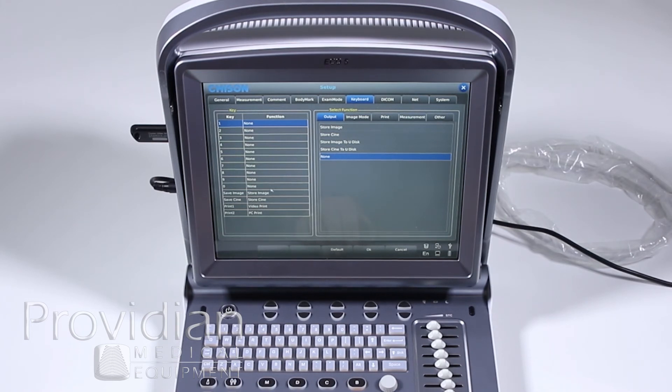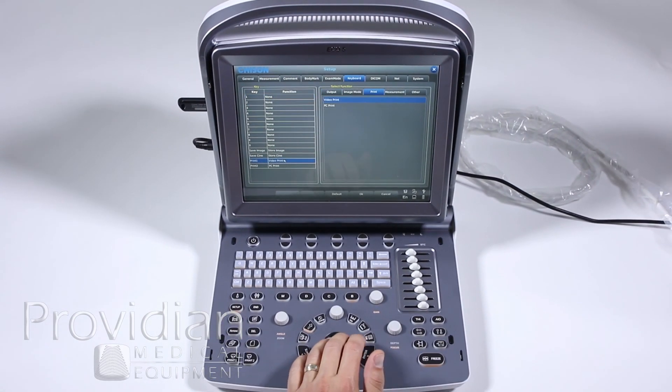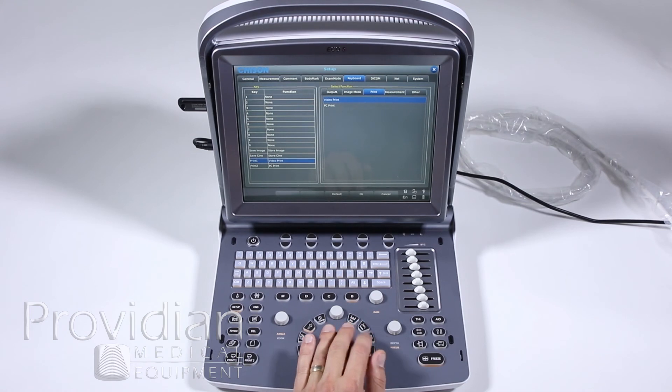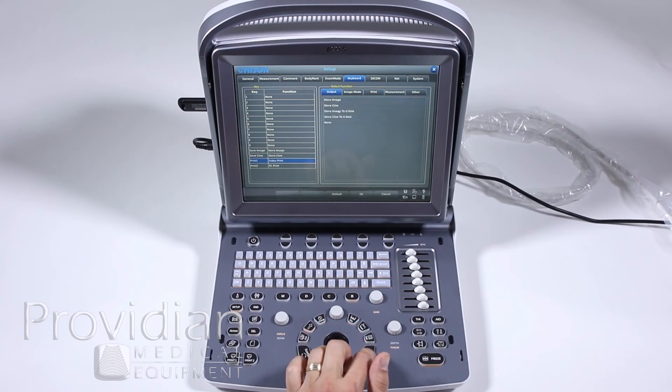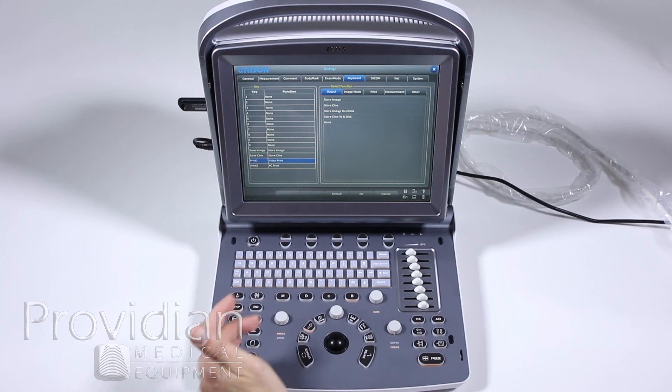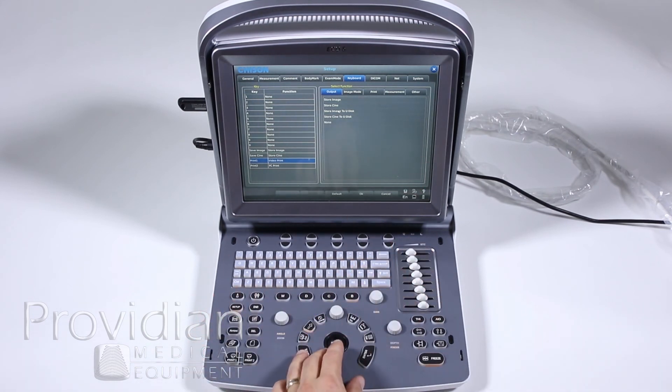What would be more helpful actually is if you don't have a printer attached, it would be better to assign print one or print two. If you want to go straight to a USB, you can say store image to U disk. So if you've got the USB, you can hit print one, it'll jump it right to the disk. Same thing with Cine.